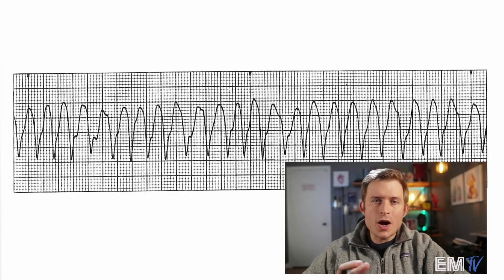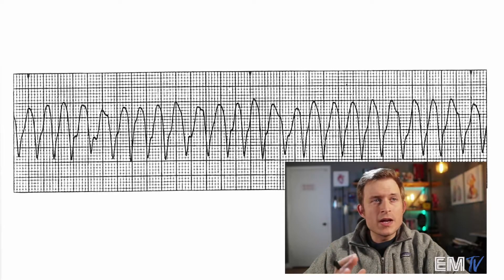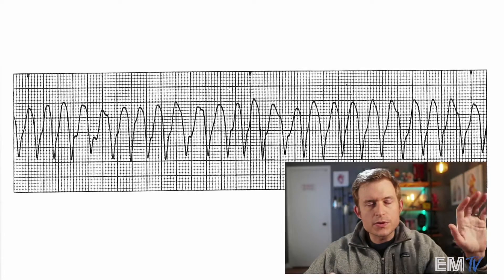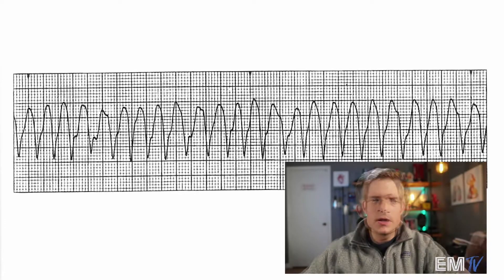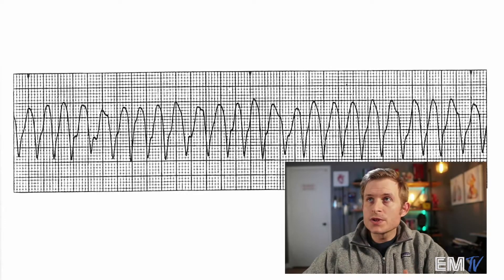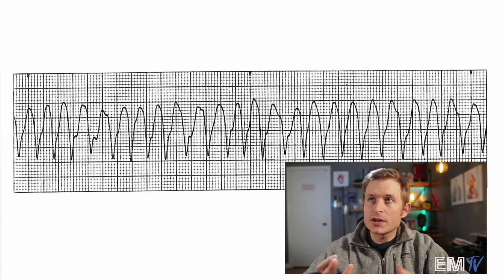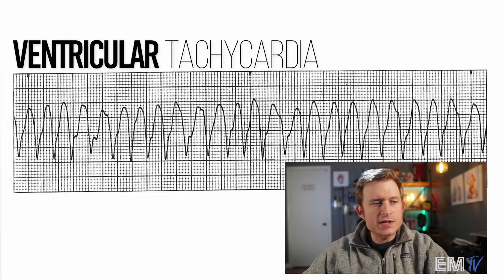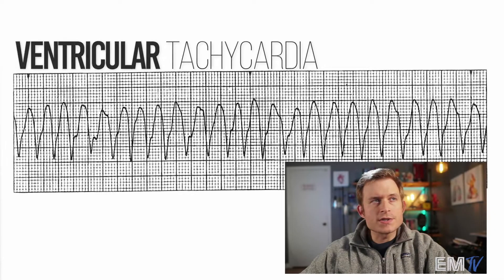Next thing you're going to notice is just how wide these complexes are. I'm not seeing any real P waves here at all, and this super wide QRS complex is going to lead me to believe this is coming from somewhere in the ventricle. No P wave, wide QRS means we've got rid of the sinus rhythm and the AV node. So what's left is your ventricular rhythms. This is well over 100, so my diagnosis here for Static Cardiology would be ventricular tachycardia. You could be more specific and say this is a monomorphic VTAC, but ventricular tachycardia is a-okay.